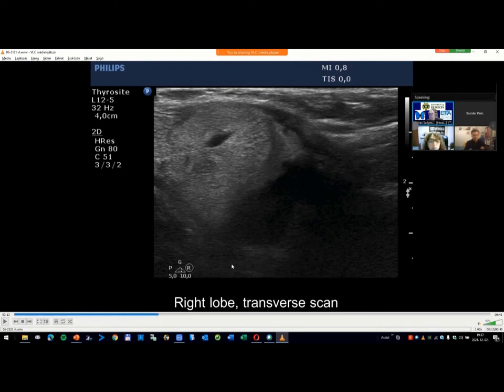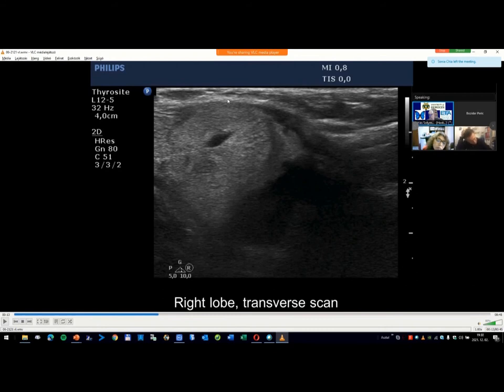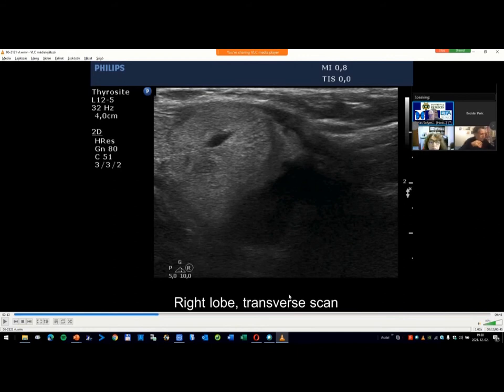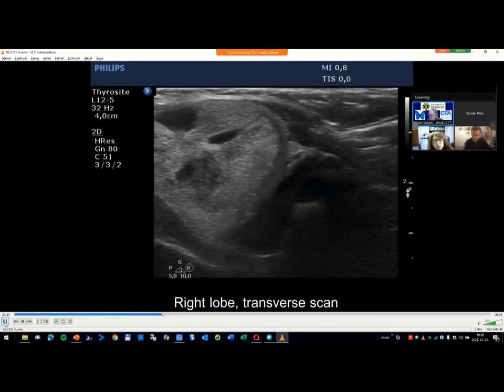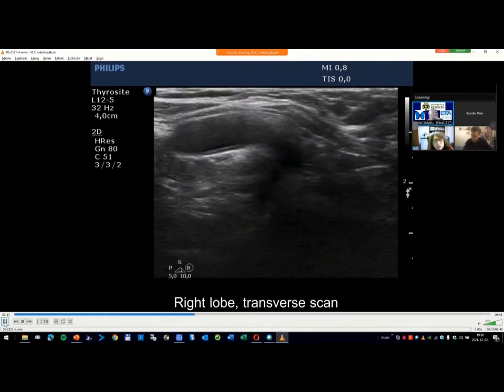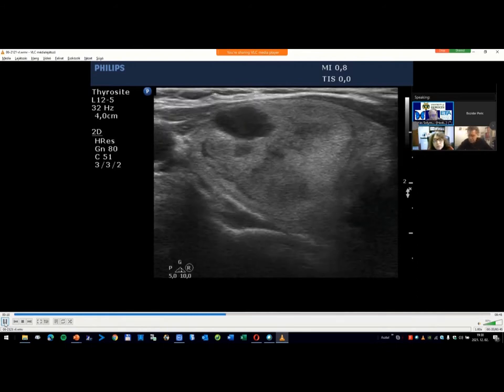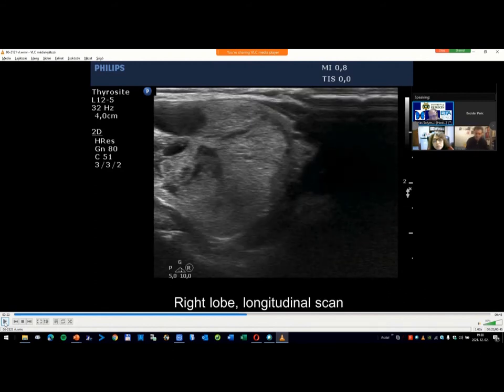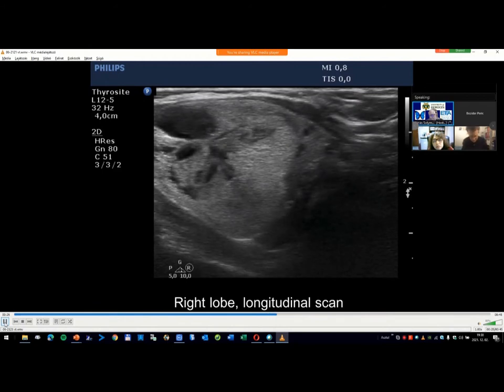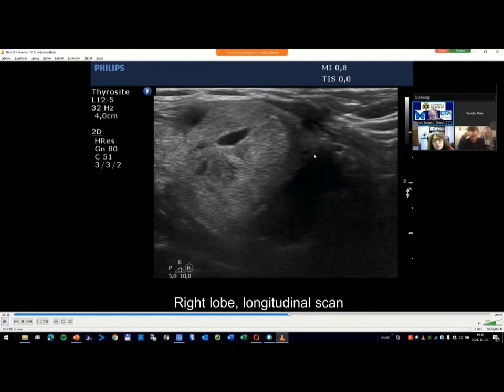One more comment: this large nodule compresses the smaller one — these are within the same thyroid pseudo-capsule. A parathyroid adenoma would be located outside the thyroid and would be less affected by this compressive sign. This is like a bag, and within the bag there is a large and a smaller nodule. A parathyroid adenoma outside the bag could not make such a great impact on a neighboring nodule. This is a circumstance which should be taken into account.